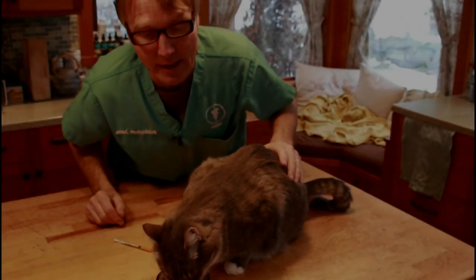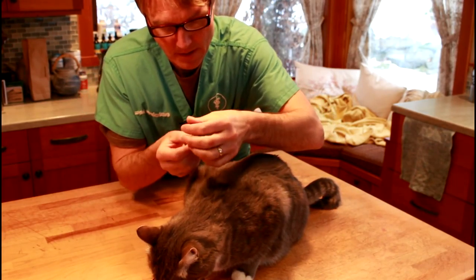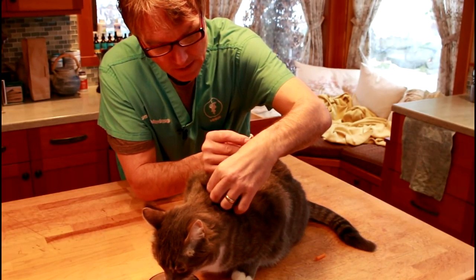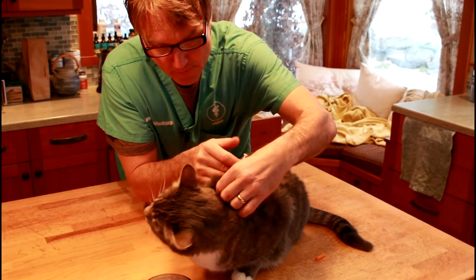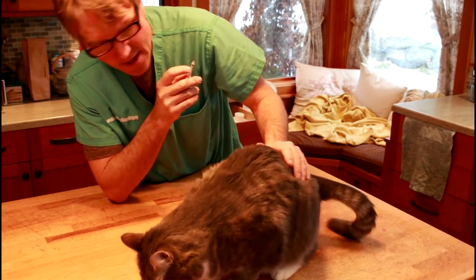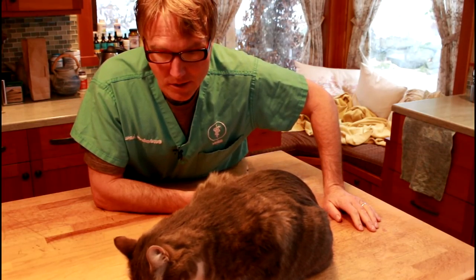He's eating, so we're distracting him. I'm going to grab a fold of the skin up here between the shoulder blades and make a little tent. Then I angle the needle at about 45 degrees — it's going just underneath the skin — I fully seat it and give him a short little injection. And as you can see, he's so focused on the food, not really paying attention to that needle.